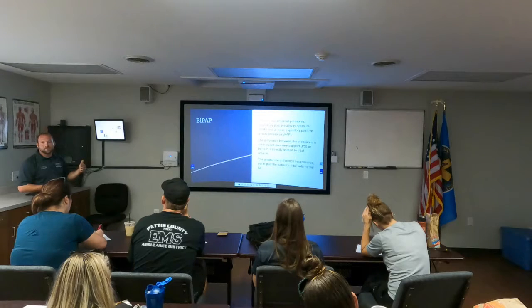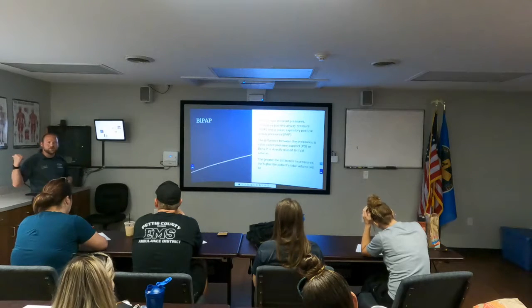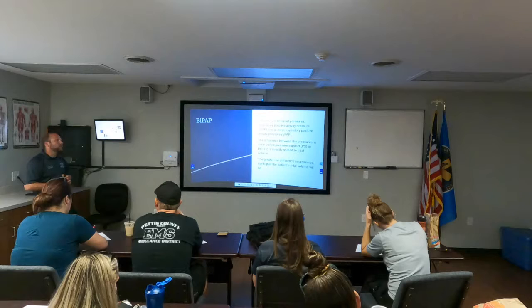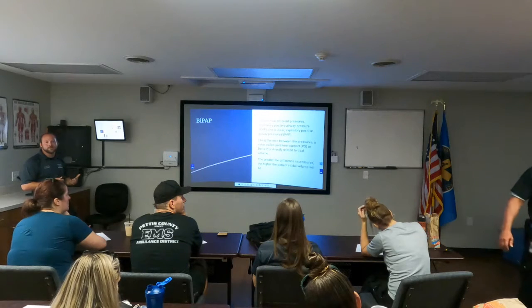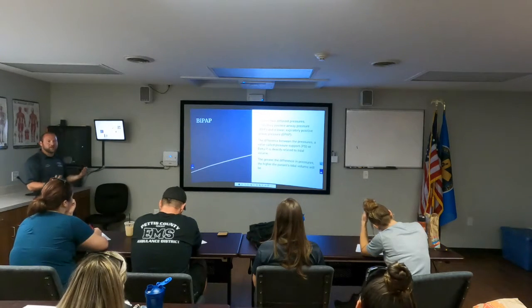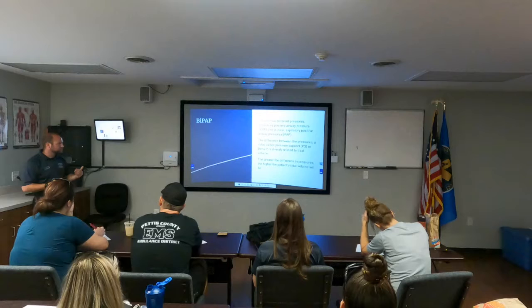Those are terms that are actually trademarked by Zoll, which is infuriating because when you go up to Bothwell, they are not using a Zoll ventilator, they're using Philips. So just knowing that interchange of terminology will help eliminate some confusion when asking what your settings are, or when you're looking at that vent to copy those settings, or to at least start somewhere, you have an idea of what we're looking for.